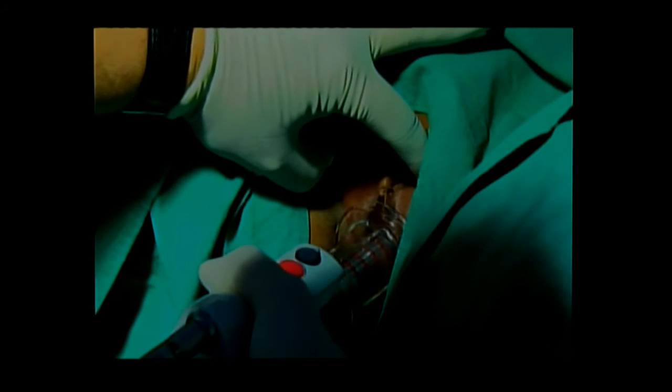You see the probe is now rotating slowly, firing laser around at that level. When it completes 360 degrees, it comes out 1 centimeter by itself, then fires, then 1 centimeter more. When it reaches the introitus, the power will automatically decrease to 25.